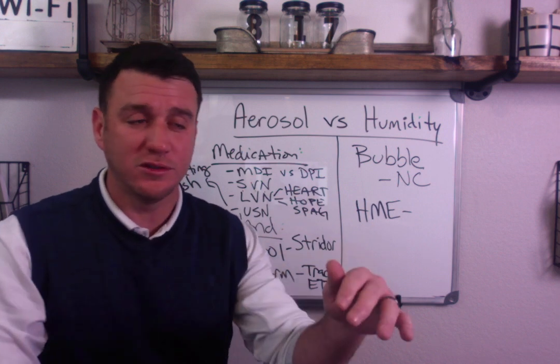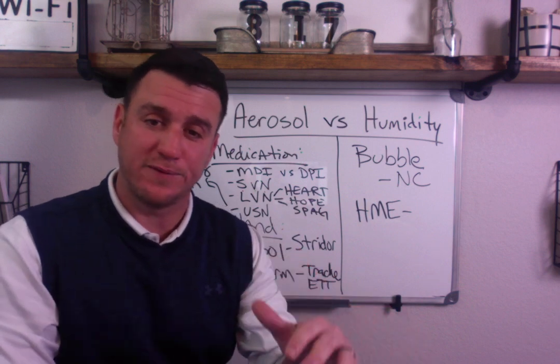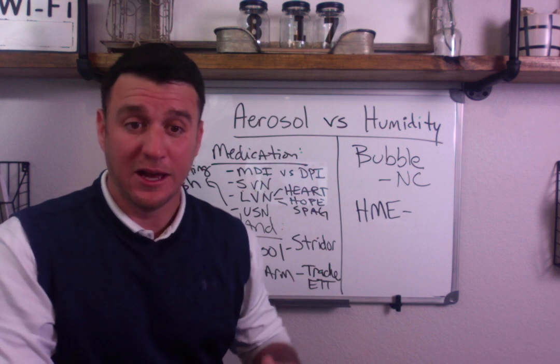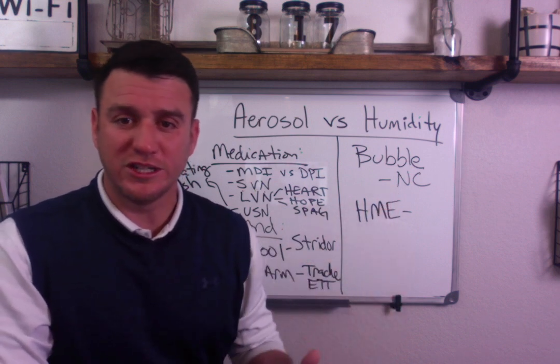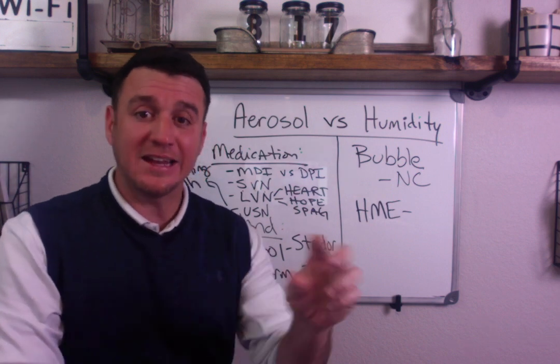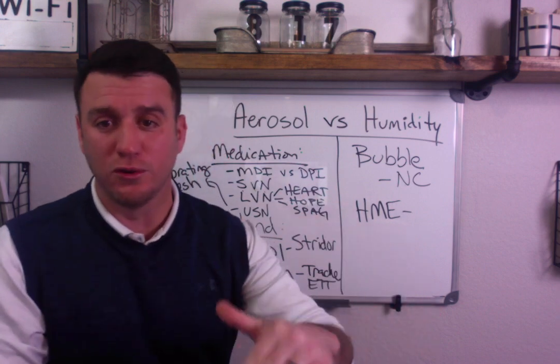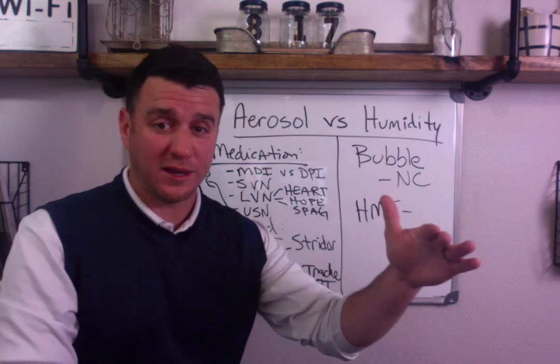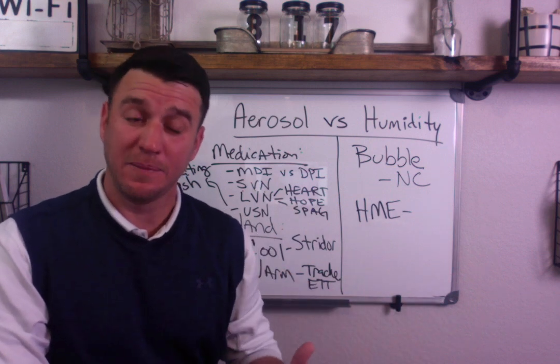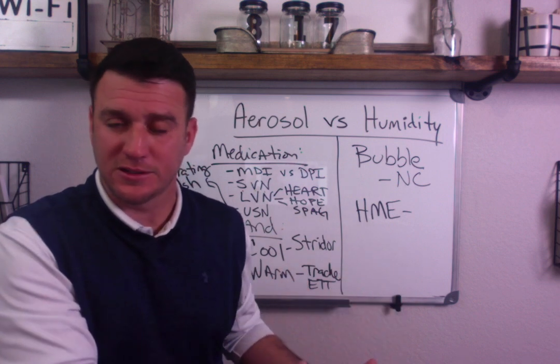Look, you can go on YouTube, you can go on the internet, look at research, you can do whatever you want to. What you will find is that mucociliary clearance, the beating of the cilia that moves out secretions in our patients and in us, me and you right now, goes down as humidity goes down, and it decreases with cooler gases. So the warmer the gas and the more humidified the gas, the better the function of the cilia, which equates to better functioning mucociliary clearance.